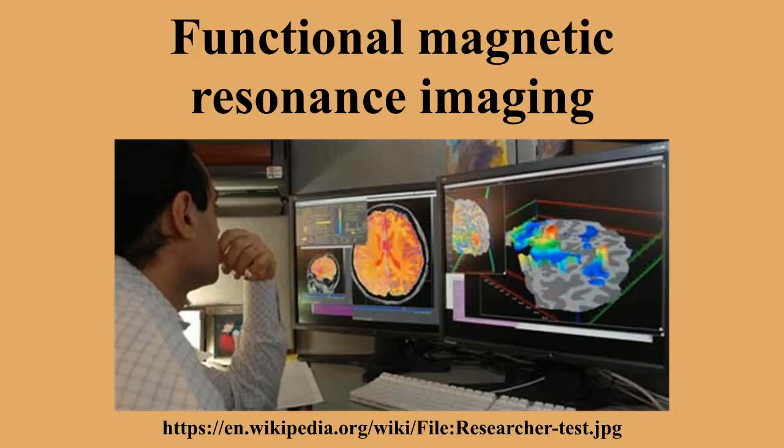Pharmacological fMRI, assaying brain activity after drugs are administered, can be used to check how much a drug penetrates the blood-brain barrier and dose versus effect information of the medication.